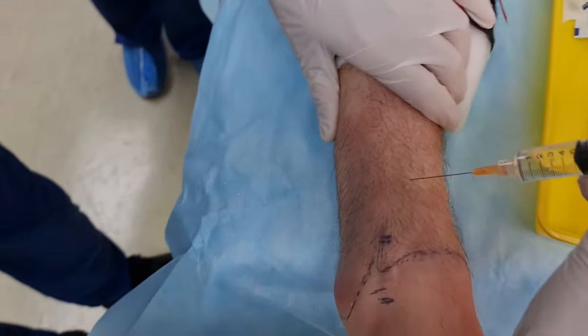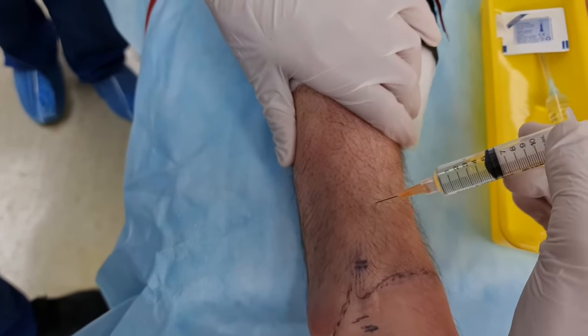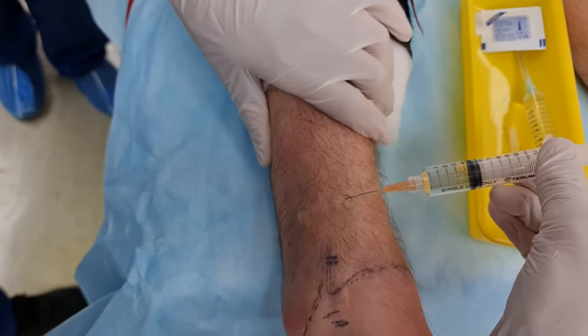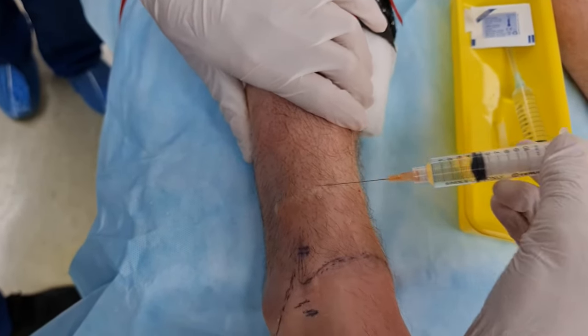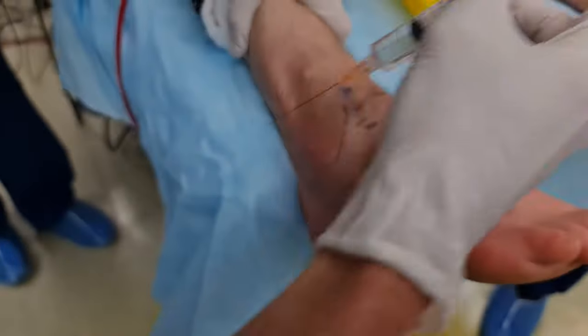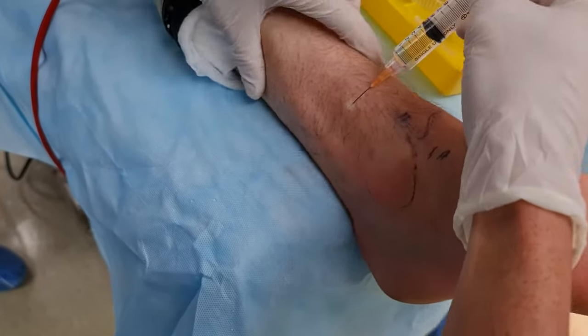You start where you've finished, avoiding that superficial vein again. Superficial peroneals — good. Now we're going to work across, still getting some of your superficial peroneal here. Start where you finish your last bleb.